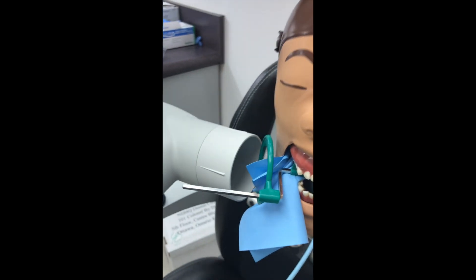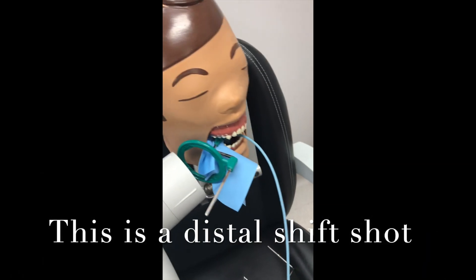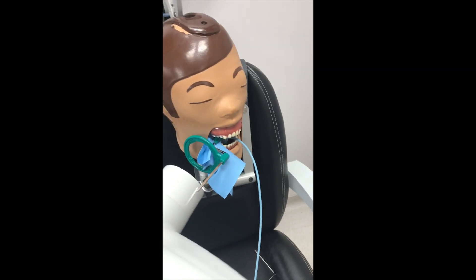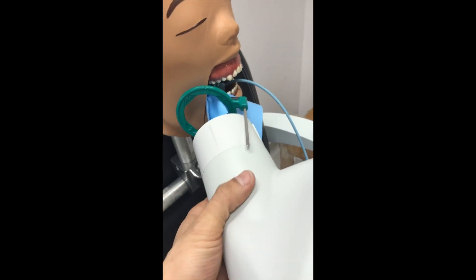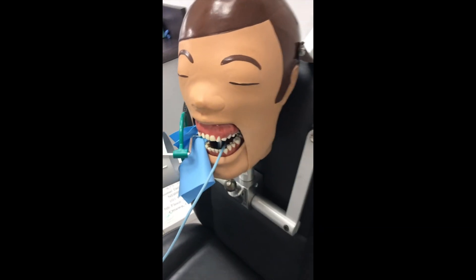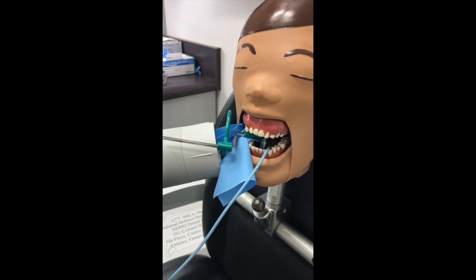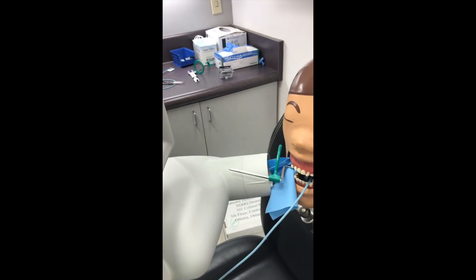So we've got that angle — that would allow us to see the mesial root, to see if our files, one's shorter than the other, using the SLOB rule. That would be a distal shot. And then if we're going to take a mesial shot, we just come underneath like that. It's a little more complicated because of the metal piece. This is with our files in — you can do this with a paralleling device, but it's much more complicated when you're starting out because the patient will push down those files. And we get our mesial shift shot, and we use our SLOB rule to figure out which file is what.